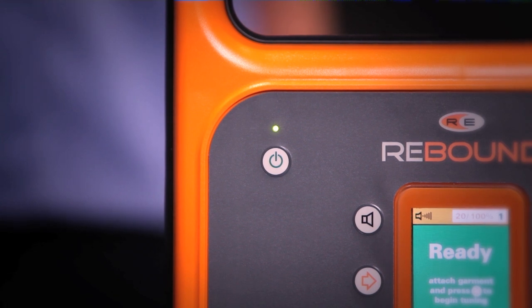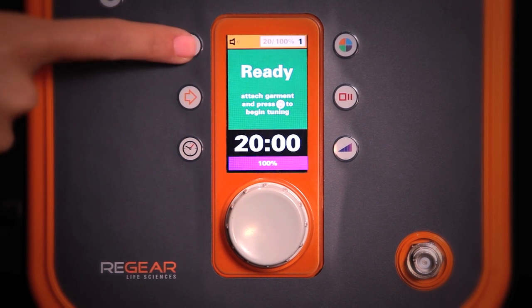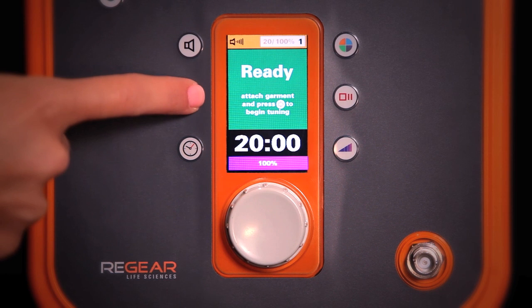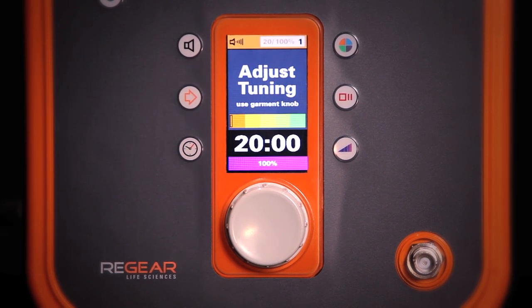Let's review what all of the buttons on the front can do. Starting from the top left: volume. There are three setting options — high, low, and mute. We recommend leaving the volume on high as that's how the Regenerator communicates with you. The continue button is the orange arrow. Anytime you need to press the continue button, the instructions will be displayed on the screen.